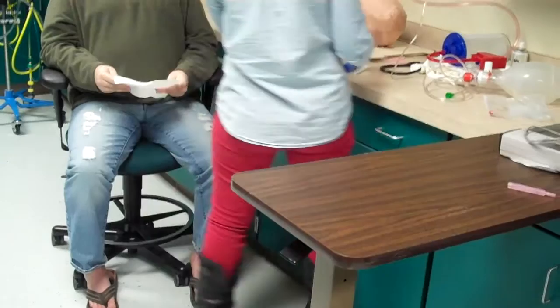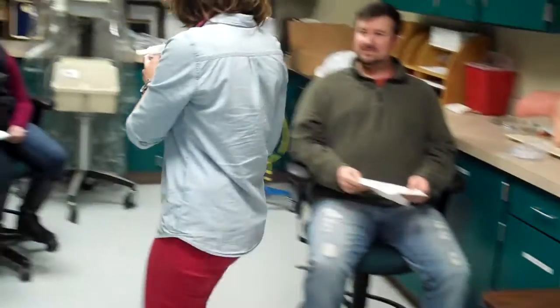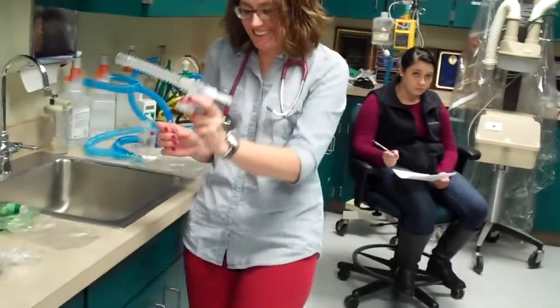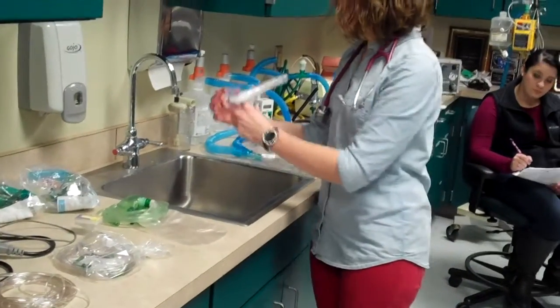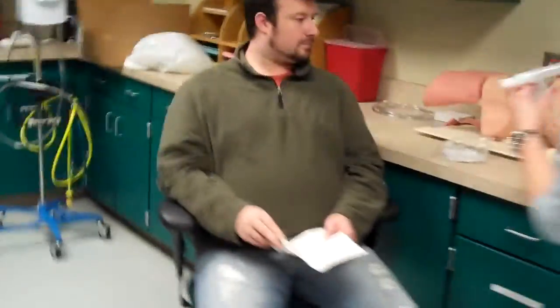Alright, good job. Get anything? Oh, got a little green in there. That's alright. Getting some stuff up. That was very smart, Victoria, to move out of the way when he was coughing, so you wouldn't get coughed on. That was excellent. What are you doing there? You're putting saline in there? Cleaning this out. Okay. I'm going to dry it out.